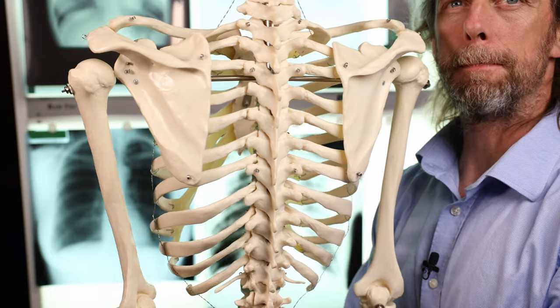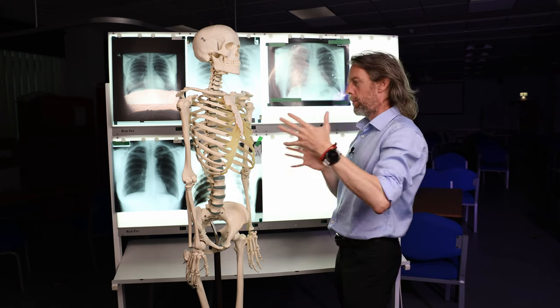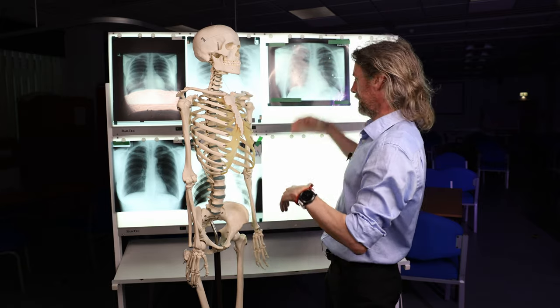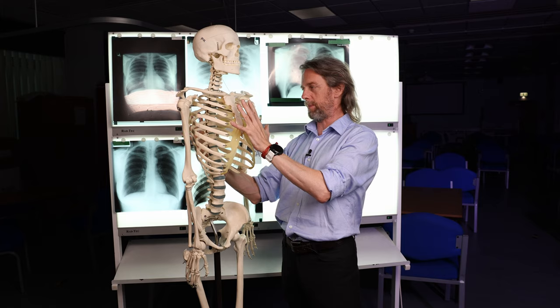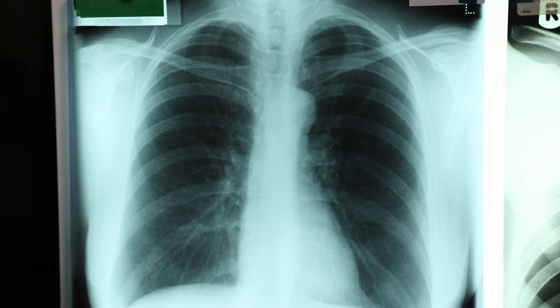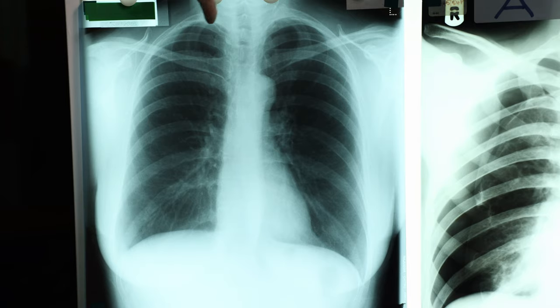Now when you're looking at a chest x-ray, of course you've got x-ray irradiation passing through the body and being detected on the other side. If the x-rays can pass easily through air, that is going to appear black on the chest x-ray radiograph, whereas x-rays don't pass through calcified bone very easily, so bone is white.